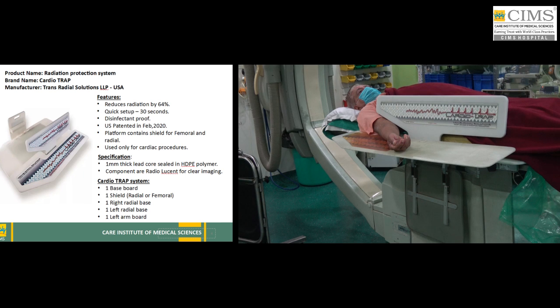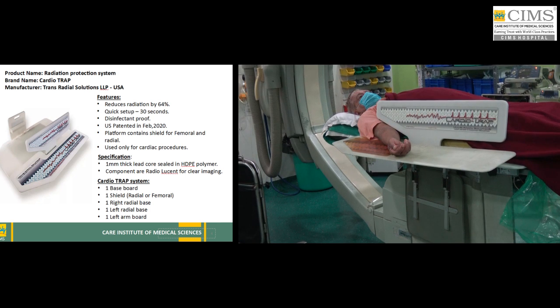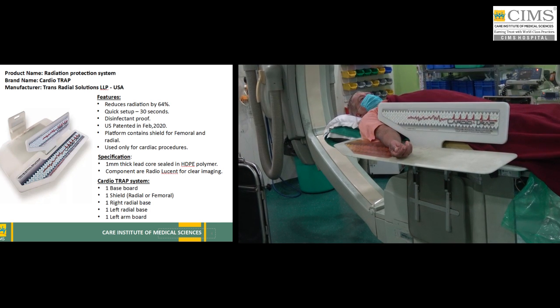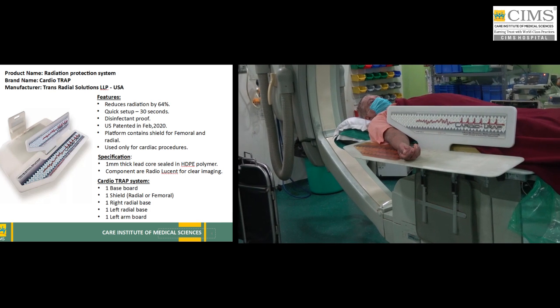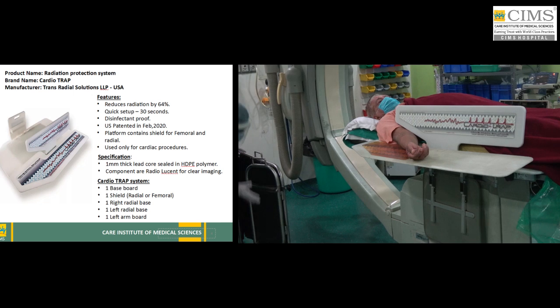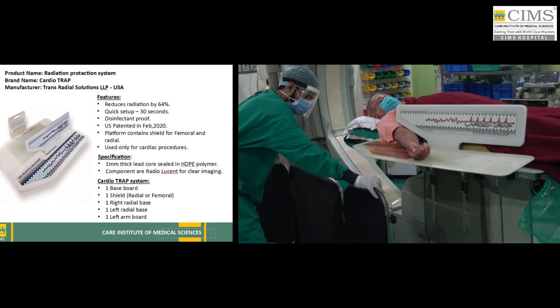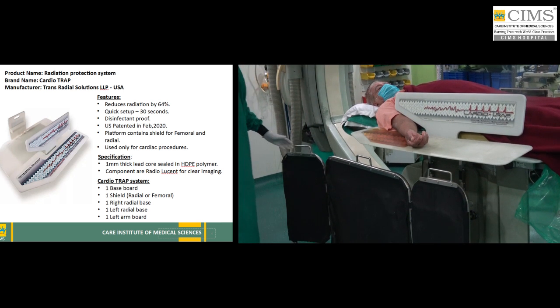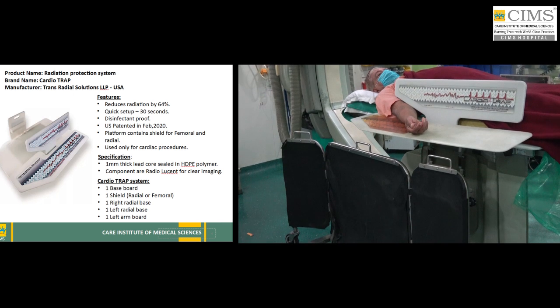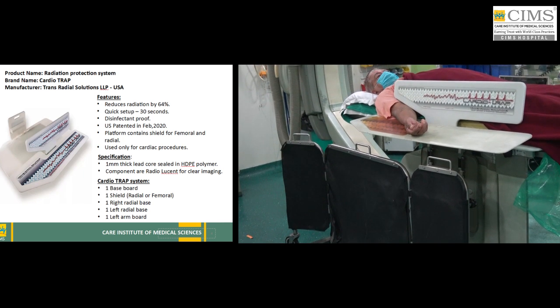Dr. Keyur, I just want to ask regarding this CardioTrap. Is this available in India? No, we got it mailed from USA, but we didn't have any difficulty. We paid them in dollars, and it just came here. You don't need any support. It's just a very simple radiation protection device. I think, Dr. Keyur, these are excellent precautions which everybody should take while doing radial procedures in their cath lab.